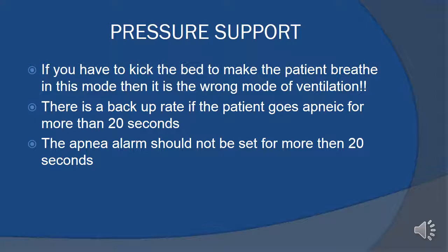Of course, the alarms start going off on the vent. It's very annoying. And you tell the physician, look, they keep going into backup. I think we need to go back on a rate. And you hear them say, just kick the bed or shake the bed, shake the patient, keep them awake. Let me tell you this, if you have to kick the bed or shake the patient to make them breathe, you're in the wrong mode of ventilation.